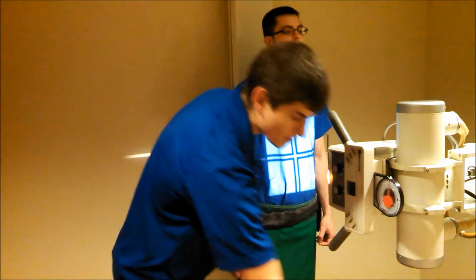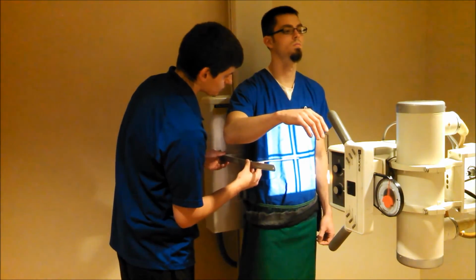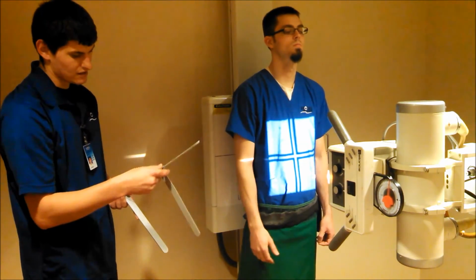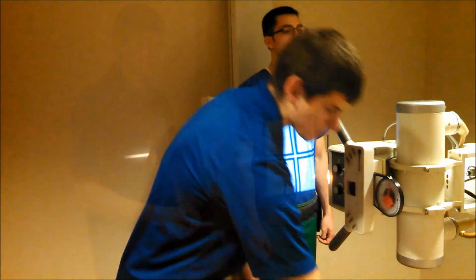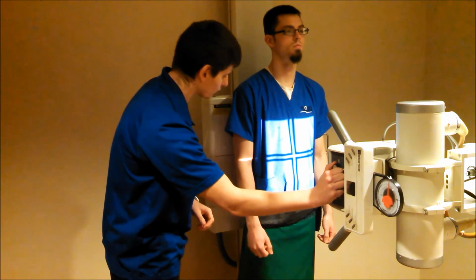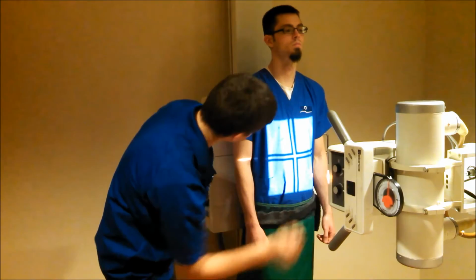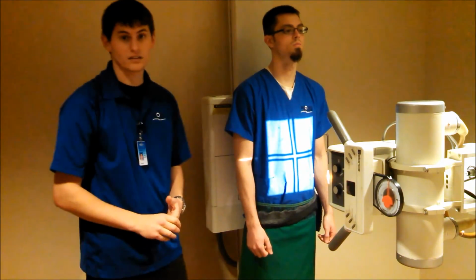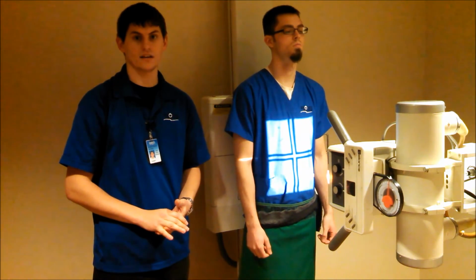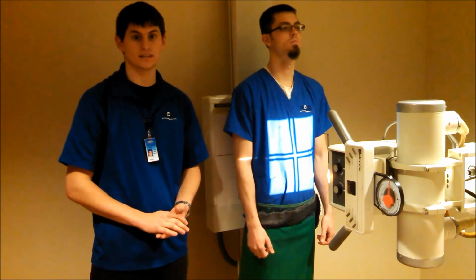Next we're going to measure. So we'll have you move your arm there. And we're going to measure from where this enters to where it exits. And we're going to measure 21 centimeters. We want to make sure that our collimation is opened up to a 14 by 17 so we do not cut any of the anatomy. Factors, we're going to use large focal spot and all 3 chambers. It was done on suspended expiration.